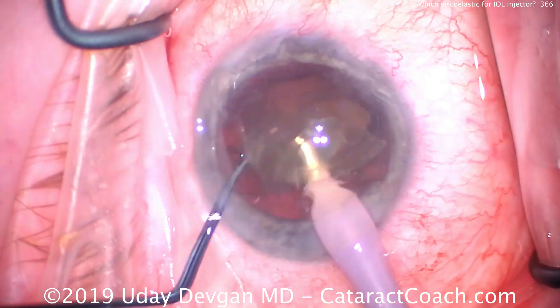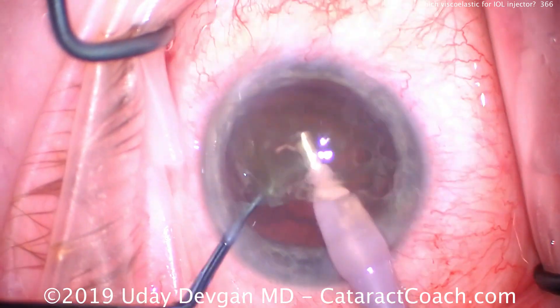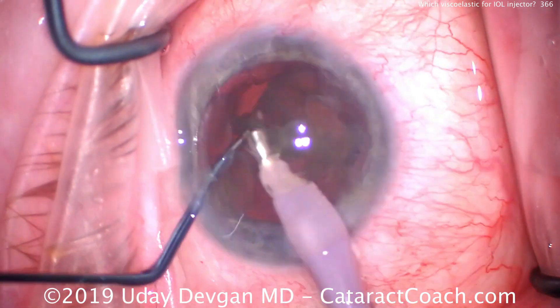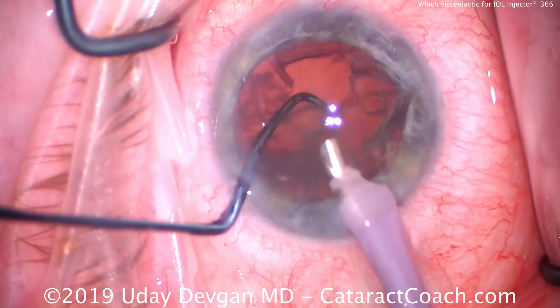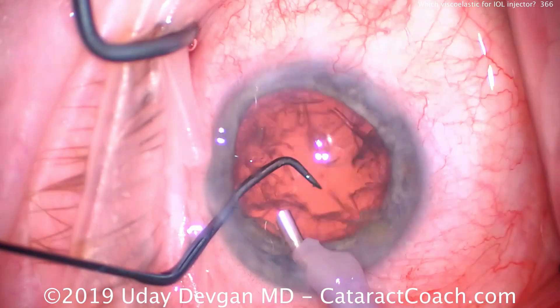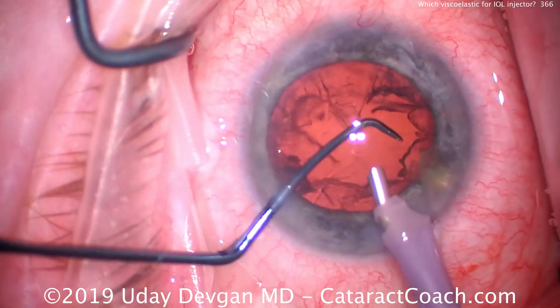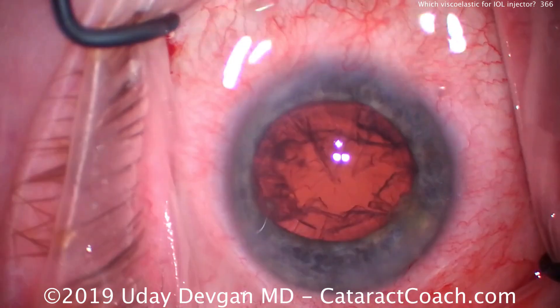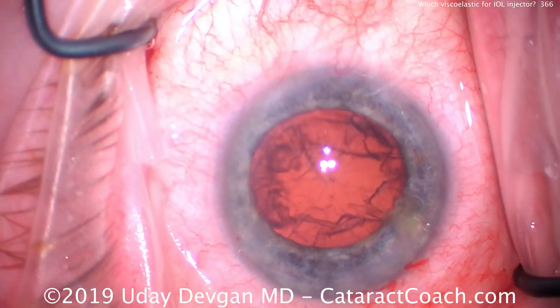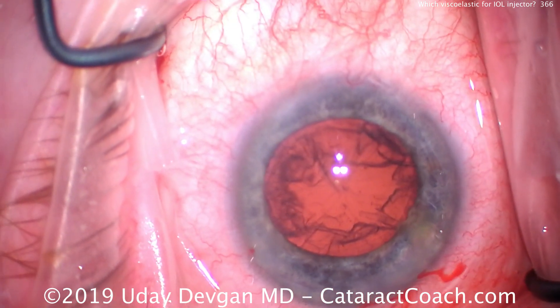Different parts of the procedure tend to call for different agents. This is why most surgeons in the U.S. tend to use two viscoelastics per surgery — a cohesive and a dispersive — used at different points during the procedure. Some surgeons use only one agent, usually a dispersive, throughout the whole surgery, and that's certainly possible as well.